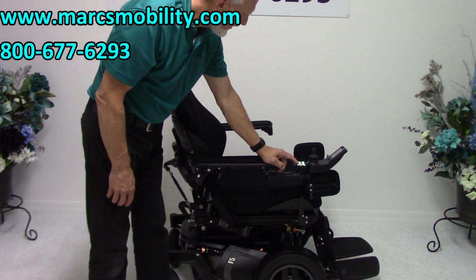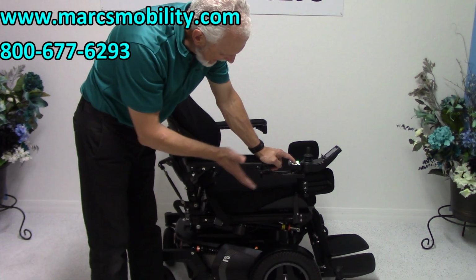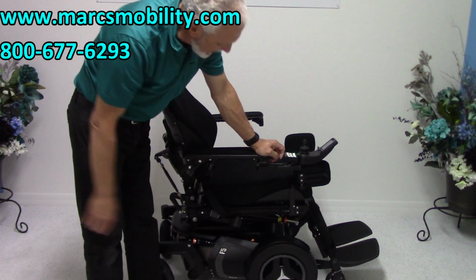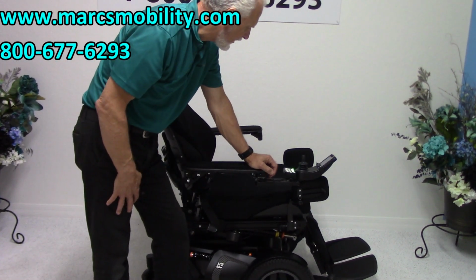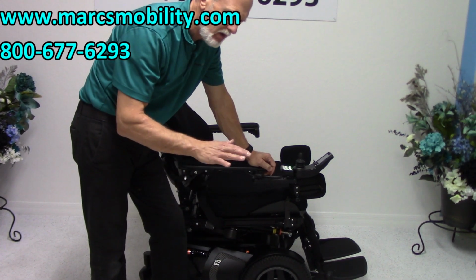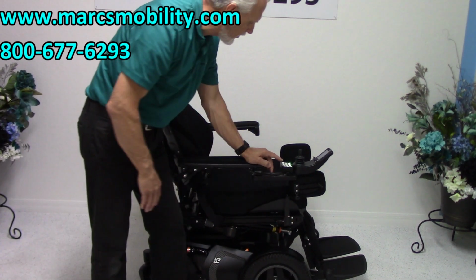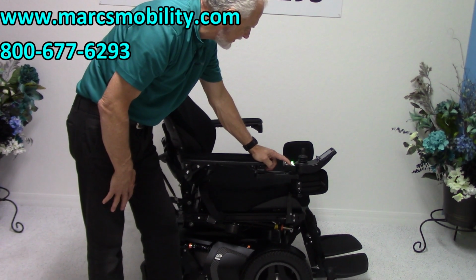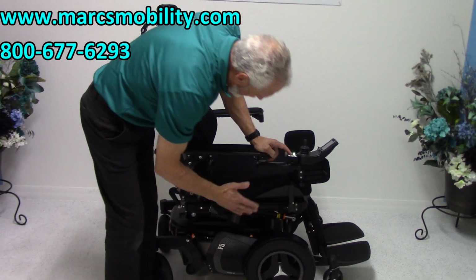So right here, if you're outside, I would always leave your legs out so you have more room under there in case you happen to hit a curve. So the next thing I'm going to show you, I'm going to bring the legs all the way back in. This chair has what's called anterior tilt, with the bottom tips outward. Let me put it on that part right there, and I will show you. So now you see the seat is flat and it's all the way down.